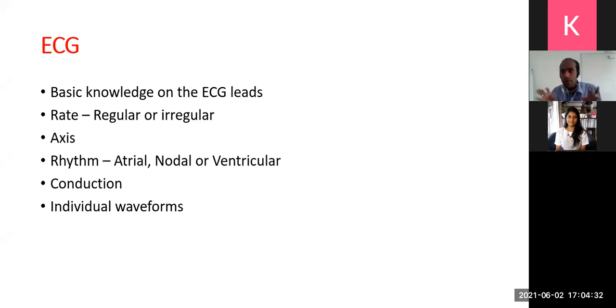The first thing we will do is get a basic knowledge of ECG leads, referring to the standard 12 lead ECG. That's quite important. Then the other 5 points are the sequence in which you should look at any ECG.